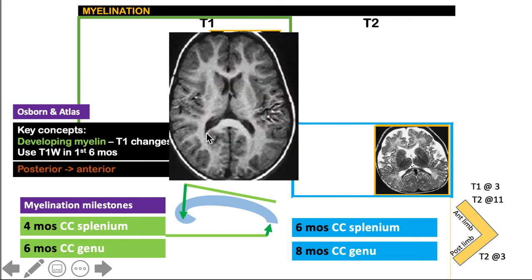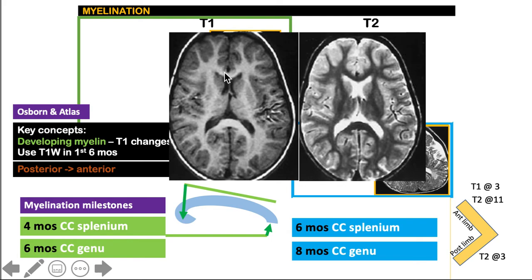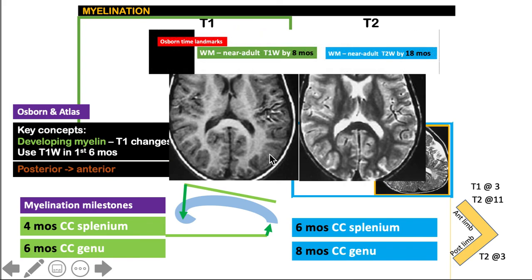In this T1-weighted image example, we see hyper-intense signal in the splenium and anterior portion of the corpus callosum. On the T2-weighted image, those same areas as well as the posterior and anterior limbs of the internal capsule all show hypo-intense signal — so this child is at least eight months from the corpus callosum findings, and at least eleven months from the internal capsule. The subcortical fibers are already myelinated here. Recalling that near-adult T1 appearance is reached by eight months and near-adult T2 by eighteen months, this patient is indeed twenty-four months of age.